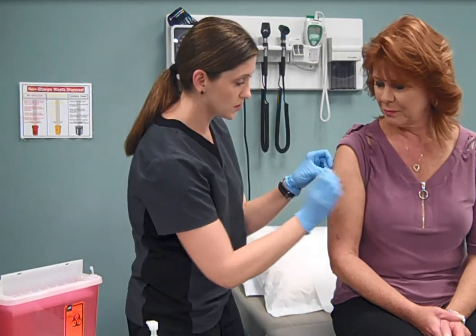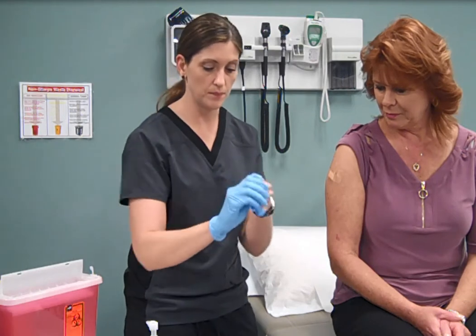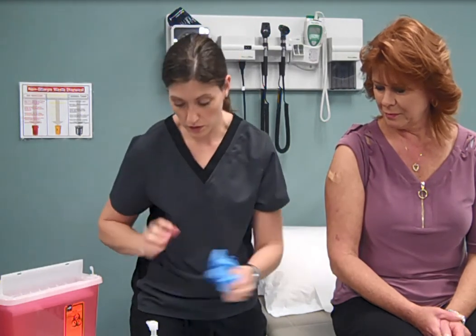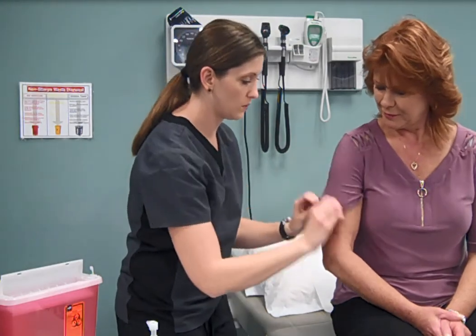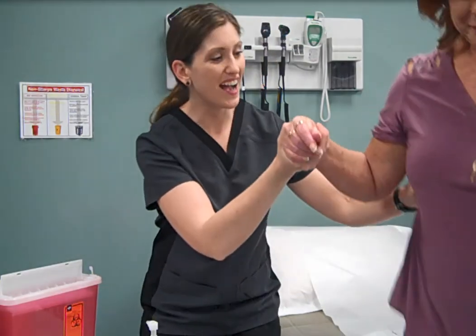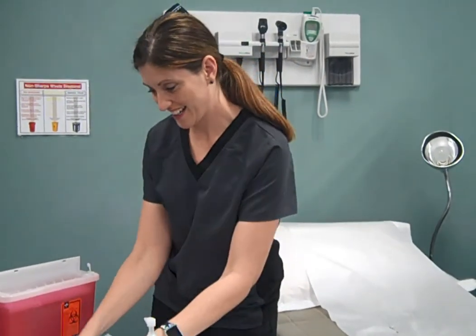Apply a bandage as needed, check on your patient, remove your gloves, wash hands, assist your patient down, and complete documentation in their chart.